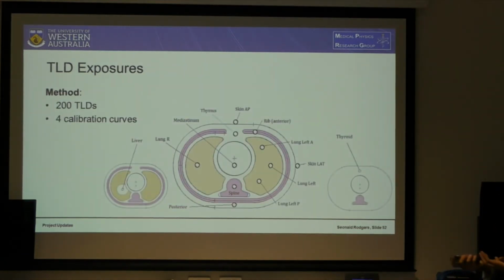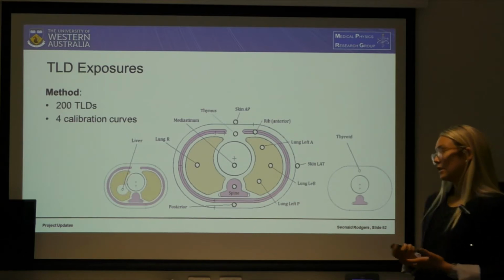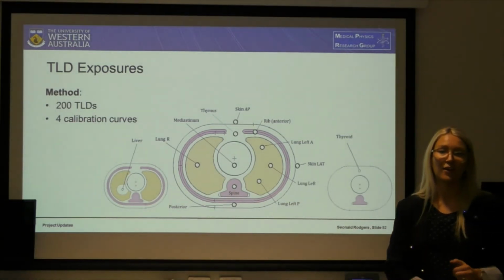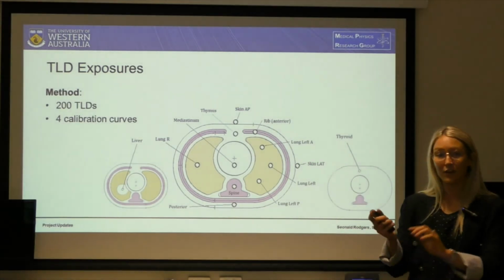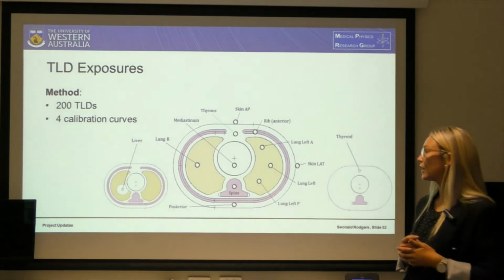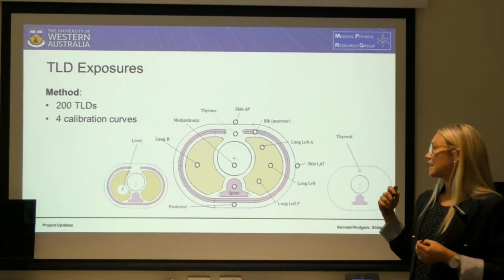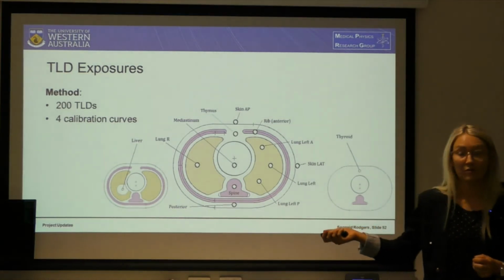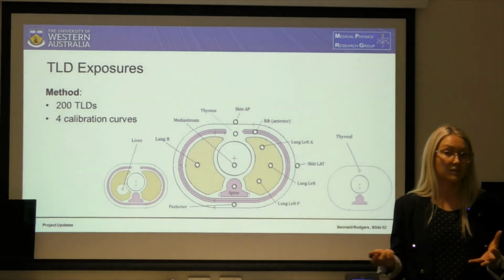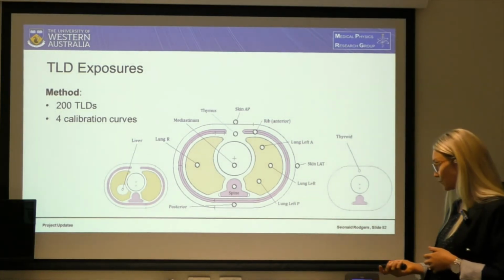So the dedicated phantom slices were used, 200 TLDs were used, 4 calibration curves were measured for each protocol, so 4 different protocols, 4 different calibration curves, and the TLDs were distributed throughout the phantom, as you can see, to measure all different dose depositions throughout the structures.